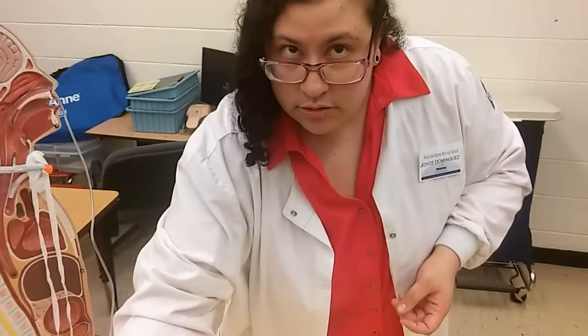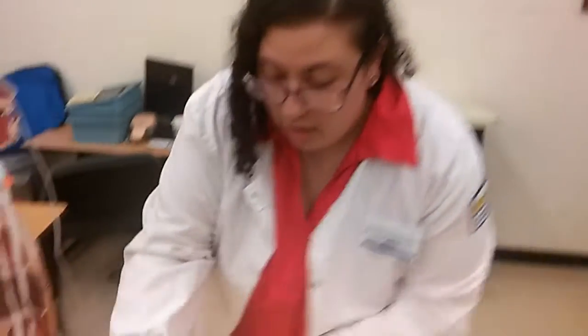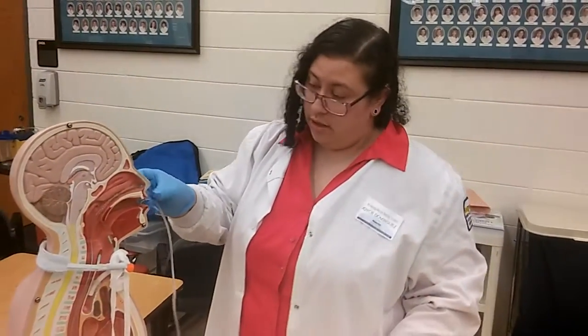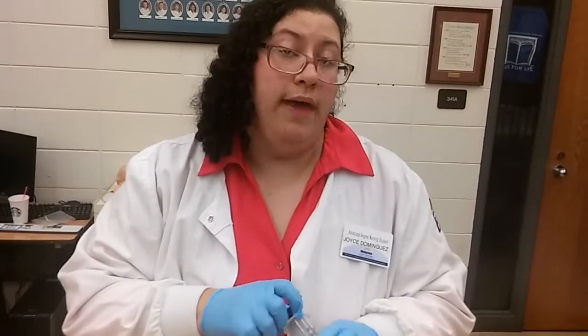We're going to provide for privacy and don gloves. We're going to check our tube placement, clamp the NG tube, and draw up 30 mLs — or the amount of irrigate ordered by the doctor.